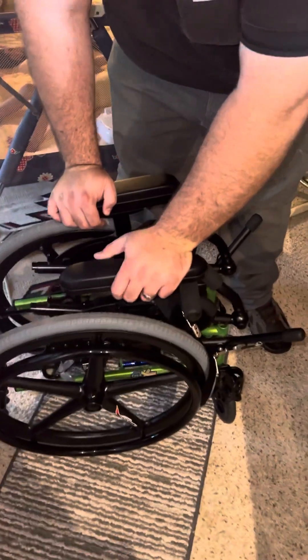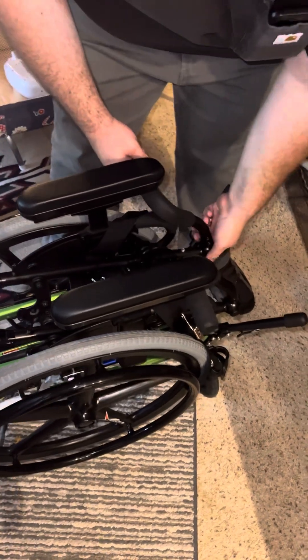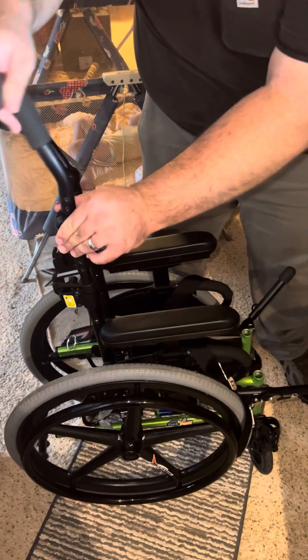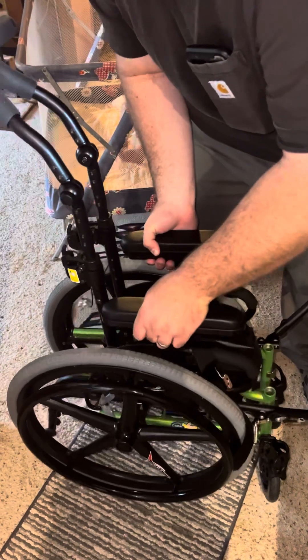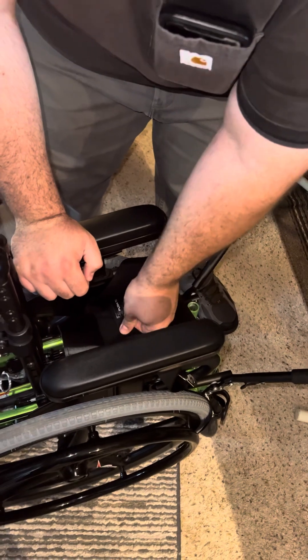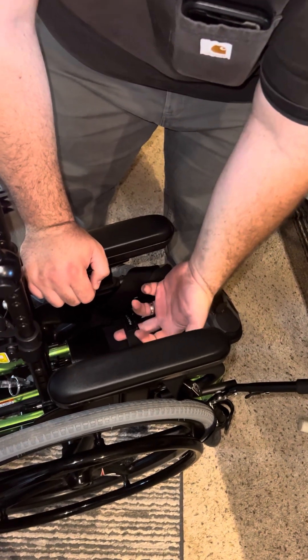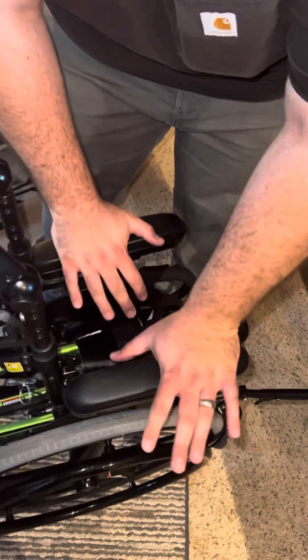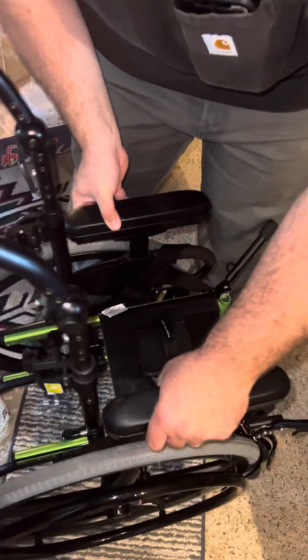To pull it back apart after it's locked — does it just spread apart? When you're setting it back up, bring the handles out. If it doesn't seem to want to pull apart, which it has a couple of times, you have to re-lift this handle. Something in here will latch sometimes when it's closed. If it did and you can't get it to pull apart, just lift on the strap again and it will come back apart.